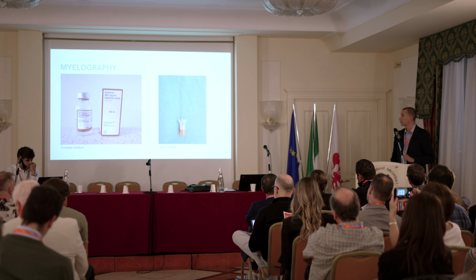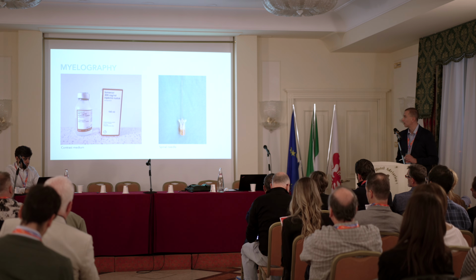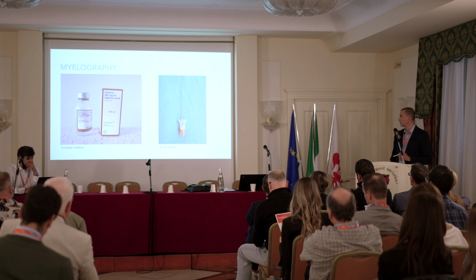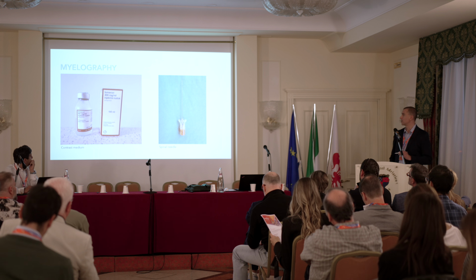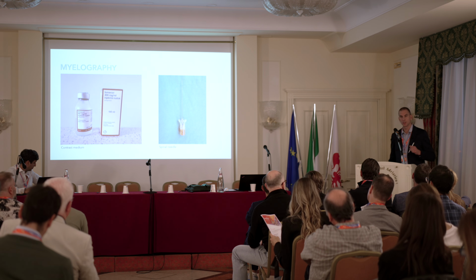On the right, this is a spinal needle. Standardly, I use this orange needle for 80% of my cases. For bigger dogs, I use the black one. I don't know the gauge, but those two are my standard needles for application.